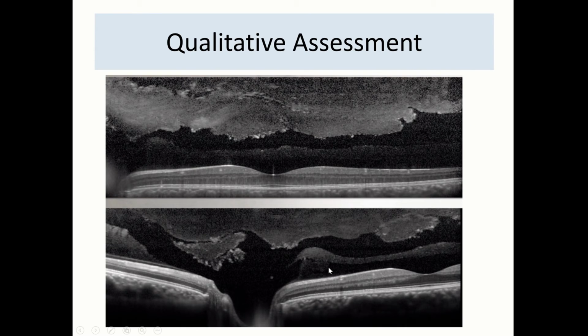This is in swept source OCT or in a regular OCT. If you move the focus forward by pressing the plus button, you can focus or give a good photograph of the vitreous. And this highlights pretty nicely, especially, vitreous separation from the macula.